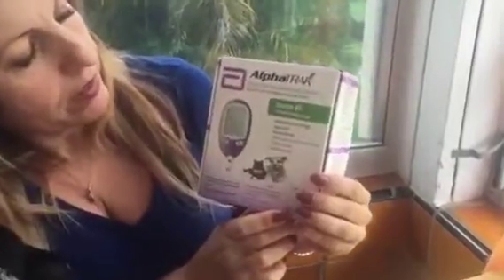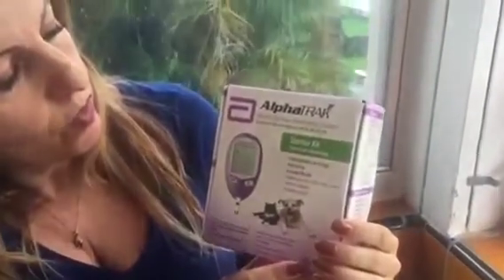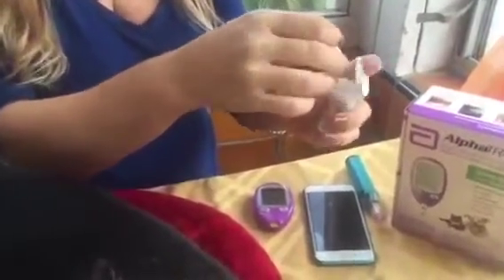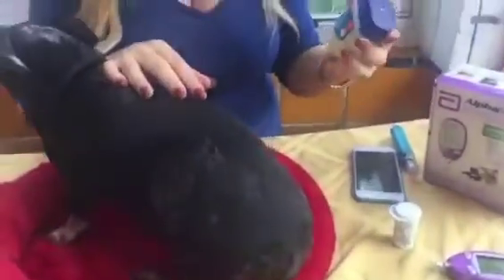Now let me show you the monitoring device that we use. It's AlphaTrak, and this is what we use to check his numbers — here it is. The testing strips are over here and I'm going to leave it here ready so that when I check his blood it's there.